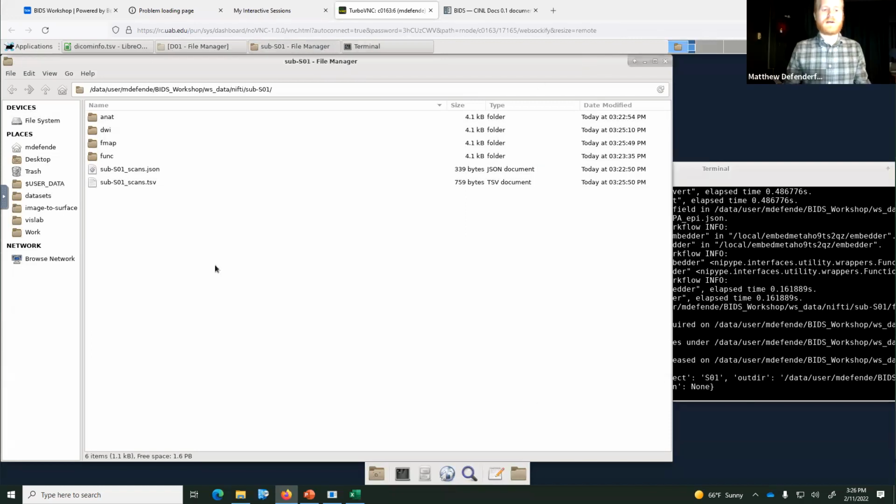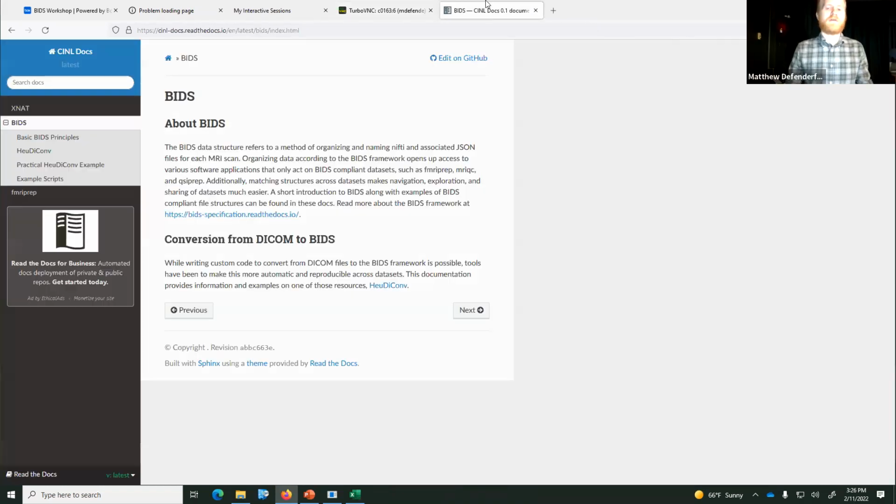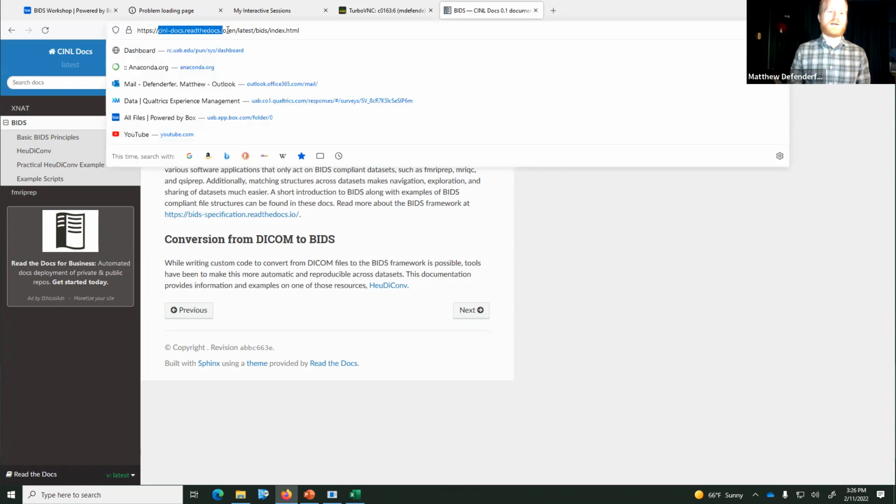If not, so this just got finished, but just briefly, everything that I've talked about, I've got slides for, which I was presenting from earlier, but there's also documentation that I've written up on our website, cinl-docs.readthedocs.io. This is a very rough website right now for documentation that the CINL thinks is useful for people doing neuroimaging analysis.